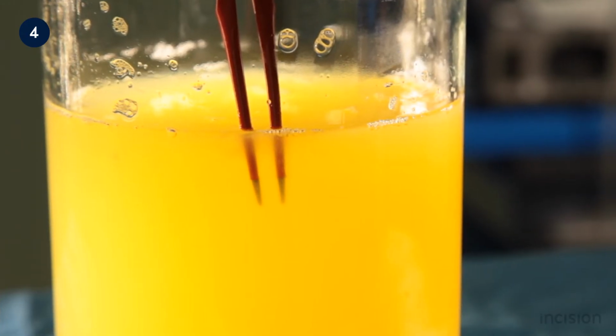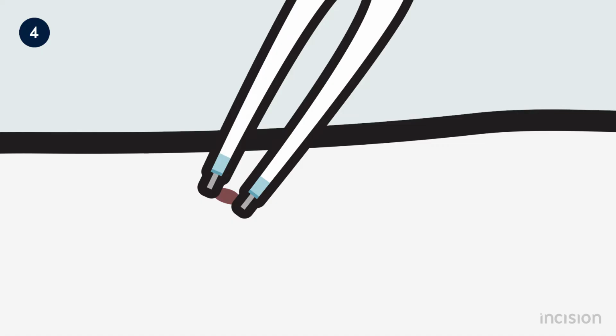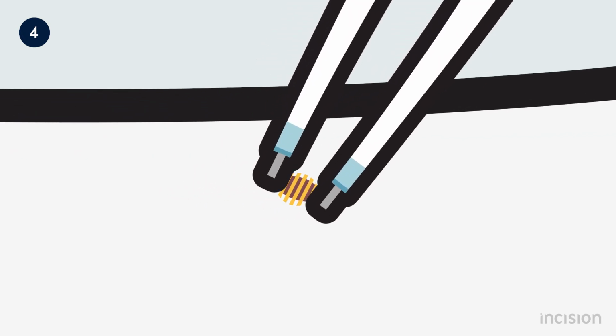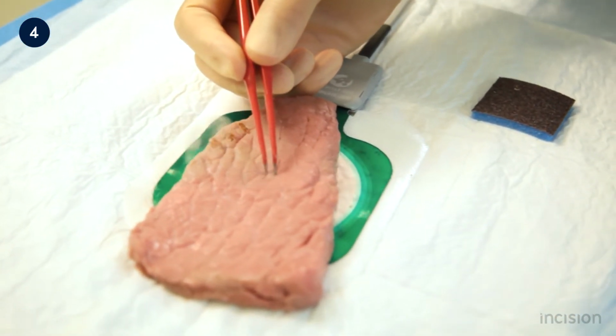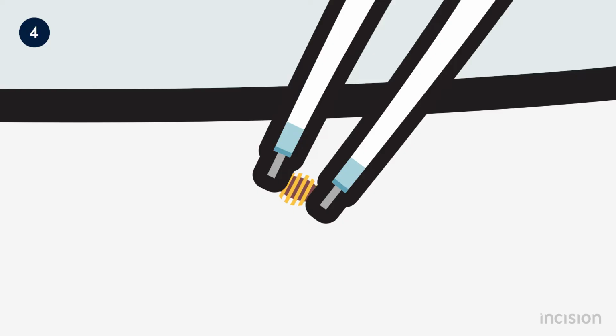When using electrosurgery in egg white, only the material exposed to current will heat and harden. Thus, it can clearly be seen that with bipolar electrosurgery, only the egg white between the electrodes is exposed to large amounts of current and hardens. As no unintended tissues are exposed to current, the method is relatively safe, yet it is less suitable for cutting applications and can only be used on tissue that can be grasped. To use bipolar electrosurgery, a small gap is required between the two electrodes, as current will otherwise not pass through any tissue.